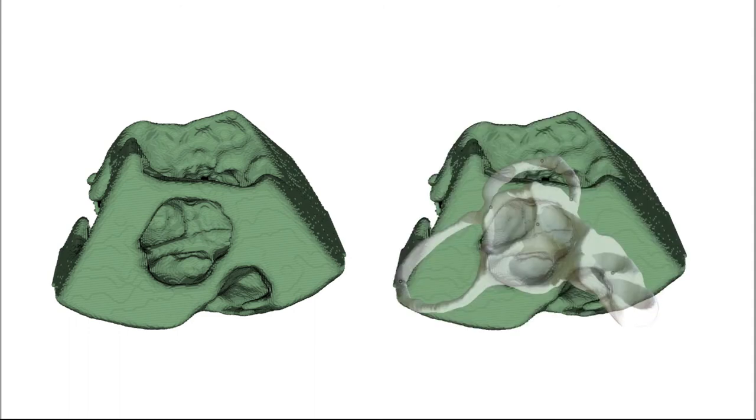We compressed the time for this workshop to leave more time for the hands-on, but all these slides will be available online. This is a kind of similar view. This one's a 3D model based on the data set. This is more of an en face view. Which cusps are fused? Non-left. This actually matches your short axis view, again, if you can picture the heart base in there. And this part is sort of behind, but that's the orientation.